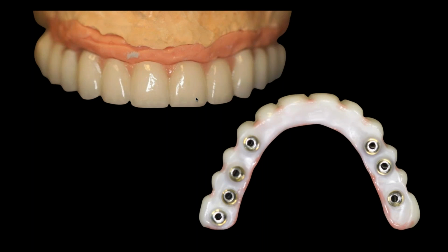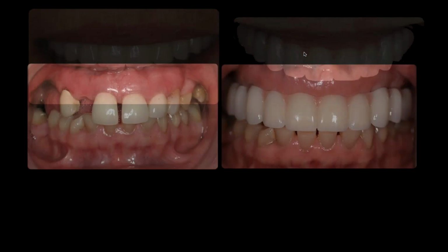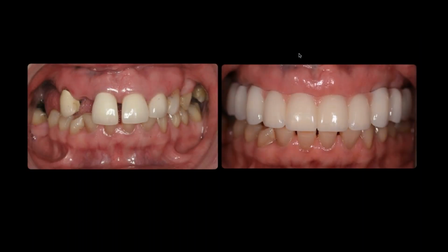And then this is her final prosthesis made of zirconia. It's screw retained. It's one piece, and it just looks great. And when she wears it, this is her. This is her upper lip, so you can see how much she shows. And he probably could have removed this papillion here if he wanted to. But she just loves it, loves it, loves it. You go from the left to the right, and she's just happy, happy.